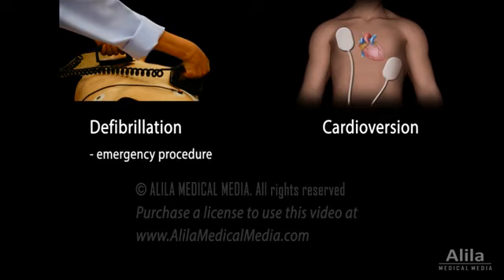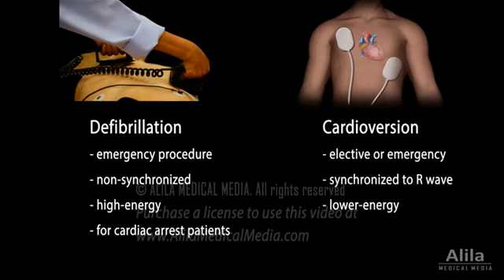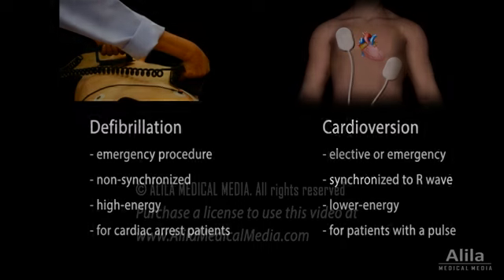Defibrillation is an emergency procedure that uses non-synchronized, high-energy shocks to treat cardiac arrest patients. Cardioversion, on the other hand, is often an elective procedure delivering a lower energy shock that is synchronized to a certain stage of the cardiac cycle.